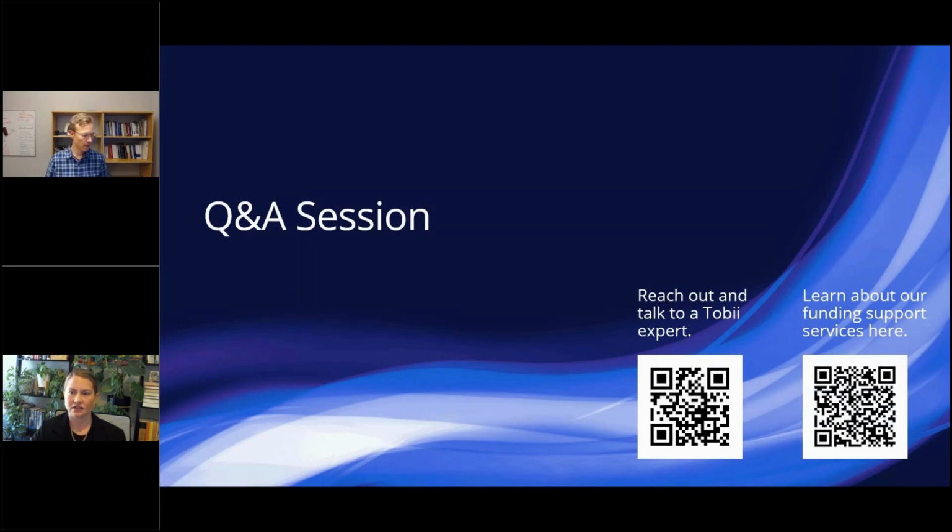Awesome. Okay, and I just have a question for you. I mentioned during my part of the presentation that there are other ways that you can measure blinks, like through EOG or magnetic search coils. What do you think are some of the benefits to using eye tracking, especially this eye openness measure, for blink detection versus other methods? I think the biggest difference is that everyone seems to agree that blinks are related to the eyelid positions and the eyelid motion. And EOG and using the pupil size signals to classify blinks are all indirect measures of blinks. So if you track the eyelids directly, then you have a direct measure of blinks. That's the main difference, I think.